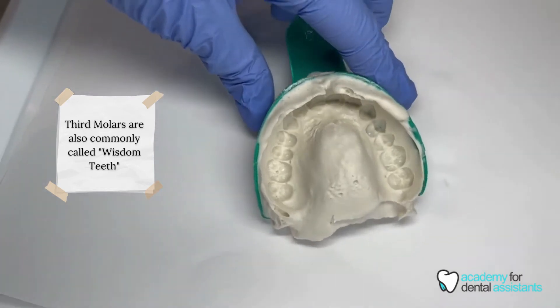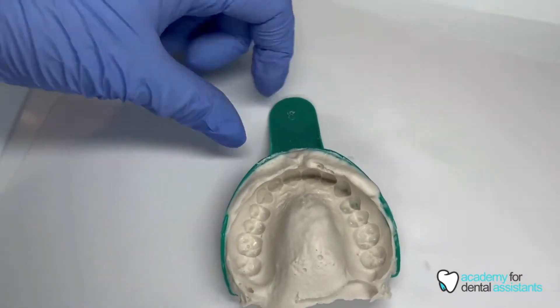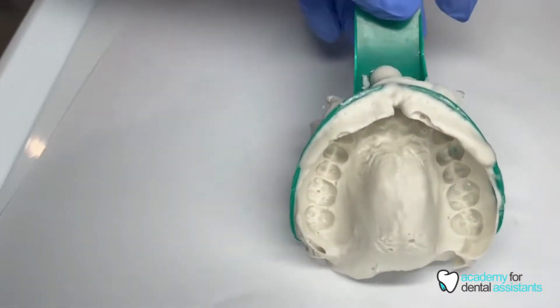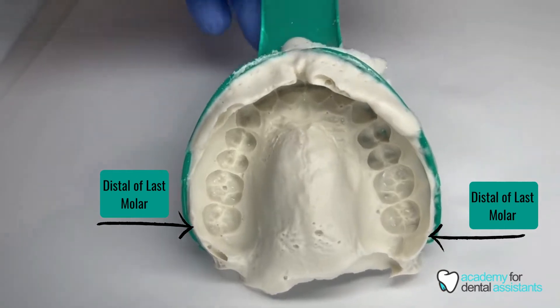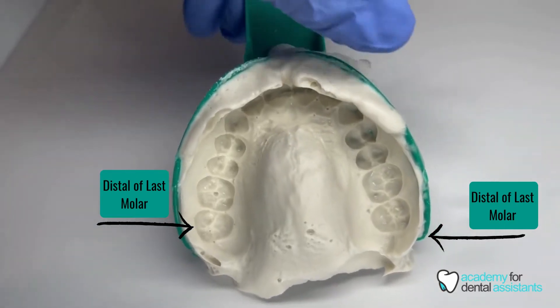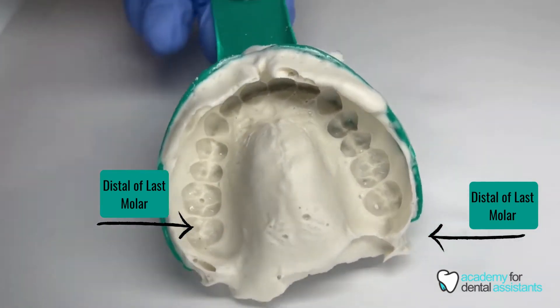It's really important that you do get the distal of that very back molar in there. As you can see, I do have the distal on both the upper right as well as the upper left quadrant.